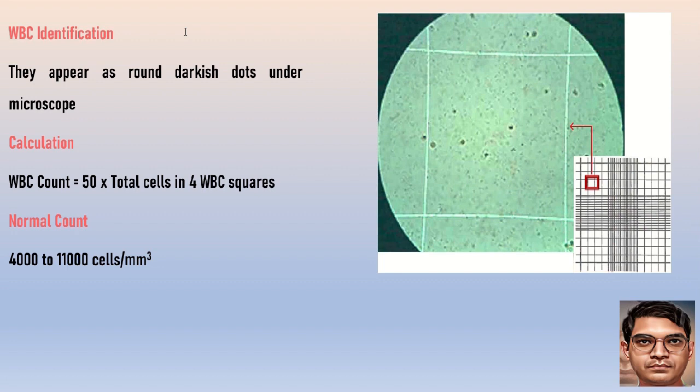Now we'll see the steps of WBC count in sequence once again.